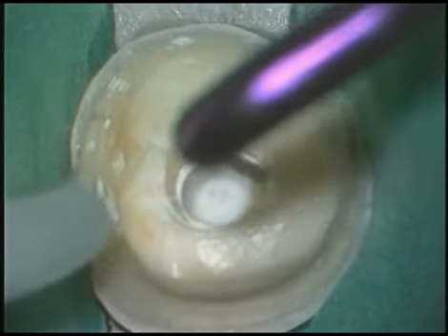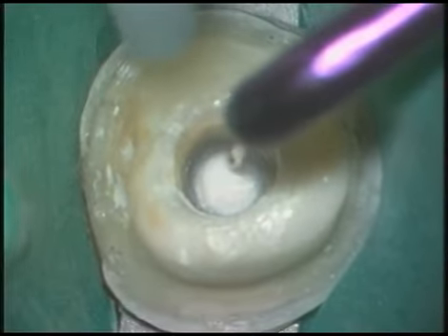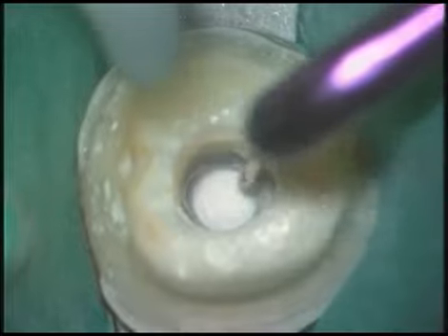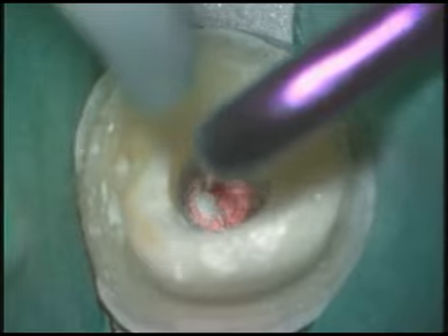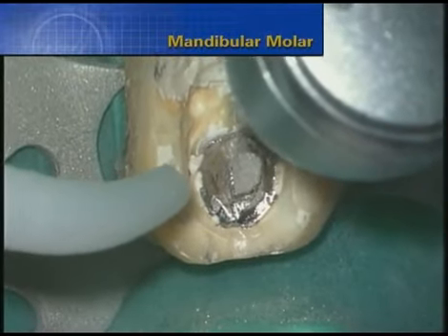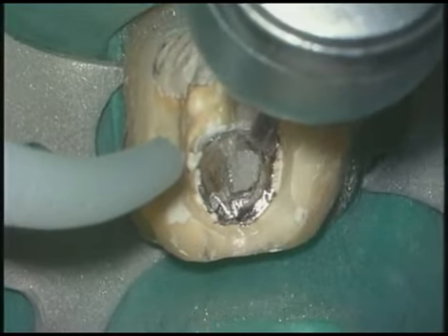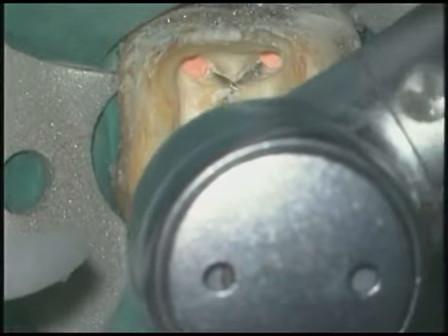Notice how rapidly it blows up glass ionomer, which was the material this post was cemented with. In a very quick fashion, the canal is completely cleaned and we see gutta percha. This mandibular molar has a cast post in the distal canal. At times, I remove the clinical crown to dramatically improve vision during my retreatment exercises.